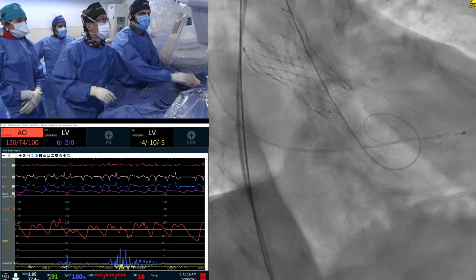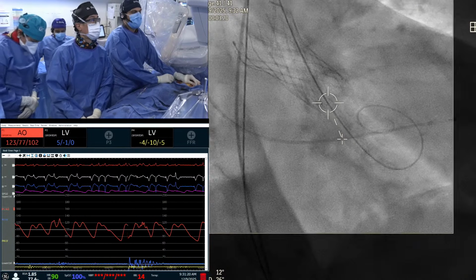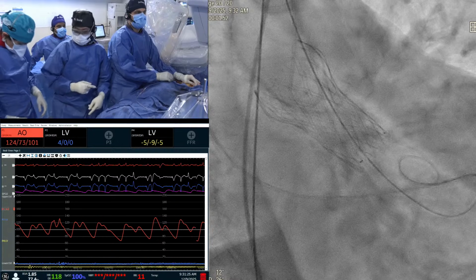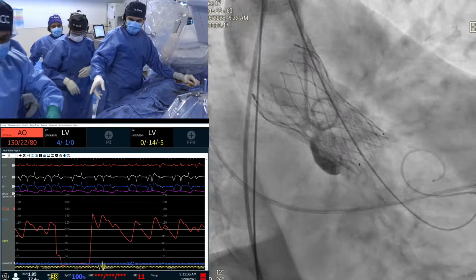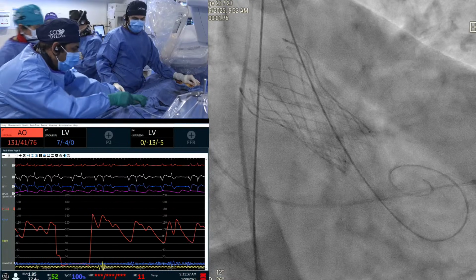And let's see where we are now. We are going to do the aortogram. Is the aortogram working now? And surgery is an option too, right, for multi-valve disease. Ready? Go. Wow, very nice, very good. So let's post-dilate. Any comments, Dr. Kinney, from the operator point of view?